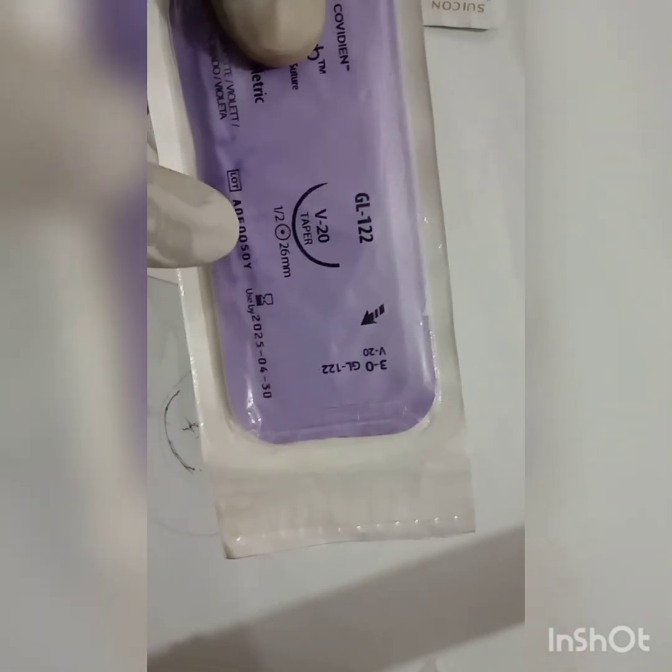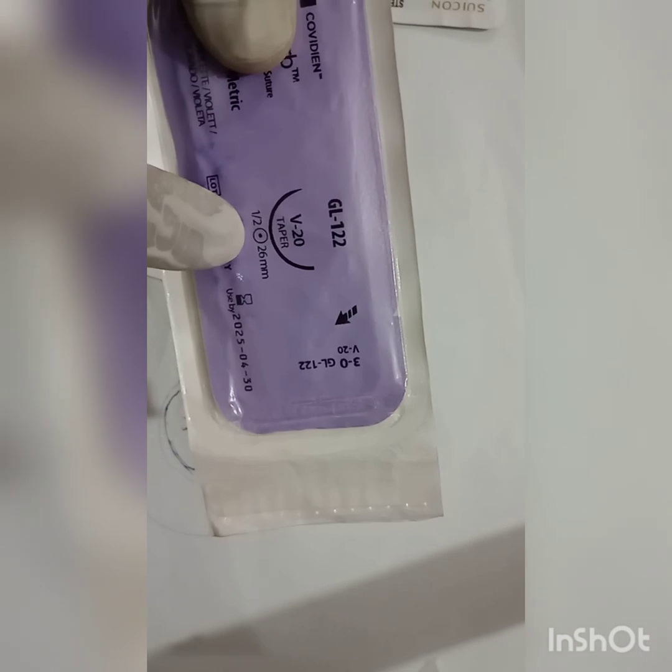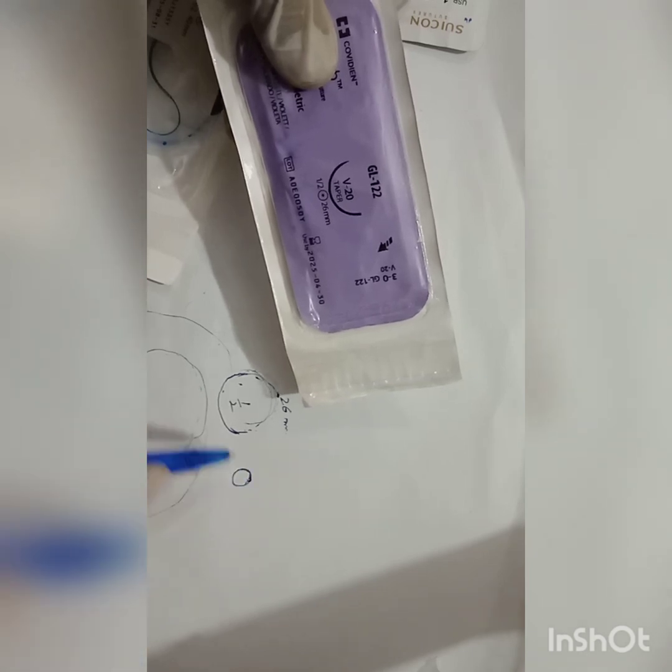Secondly, you see a dot, a circle dot is given here. That means the needle is round bodied and tapering. It is actually round. If you cut it in transverse section, you will see its body like this. So it will split the tissue, it will not cut the tissue. That's the important point. It is a round body or cutting.